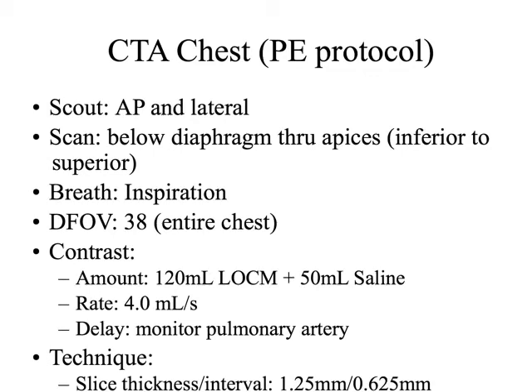The patient's going to hold their breath. One thing that's important with these studies is to not specifically tell the patient to take a deep breath in and hold it. Just ask them to stop breathing. Because if they take a deep breath in and hold it for these PE studies, it can actually force the contrast out of the pulmonary arteries due to the way the lungs function and their effects on the flow of blood. So just stop breathing. A lot of times that is what the machines are instructed to tell the patient.